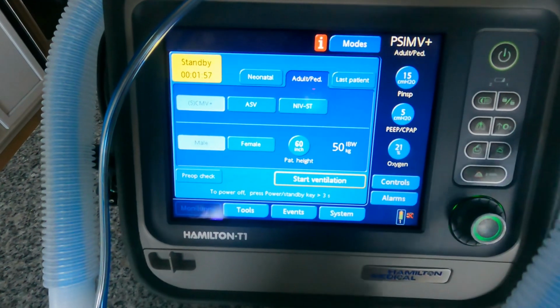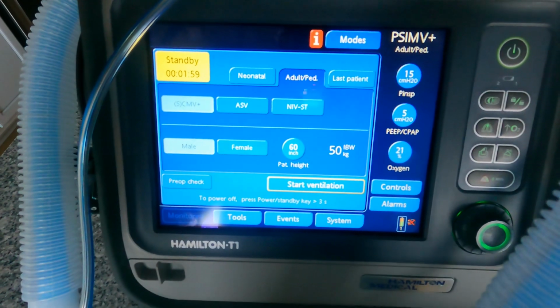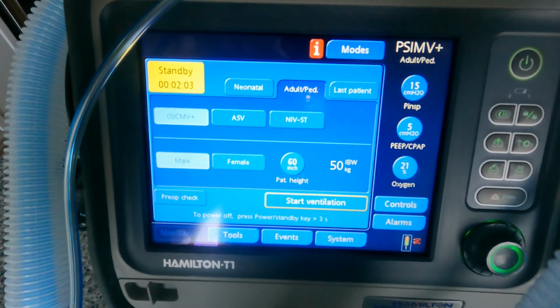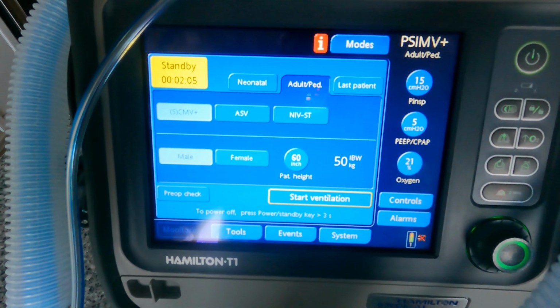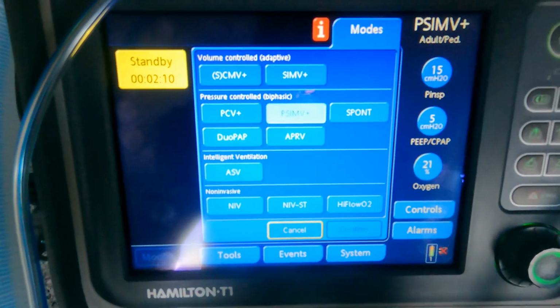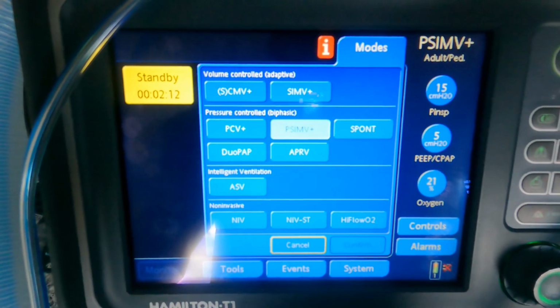So remember that difference. Other than that, most of the competency is just going to be walking through the pediatric protocol and using some scenarios to make sure that you know which mode to ventilate. But just as a quick review, with our pediatric patients, you have a few different options.